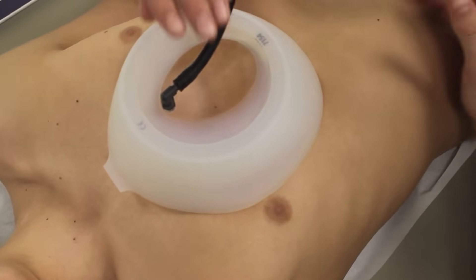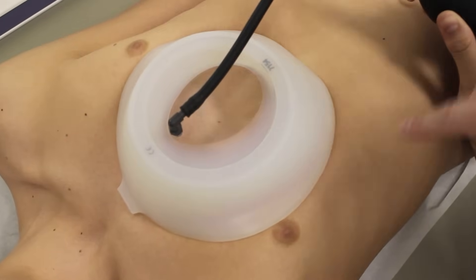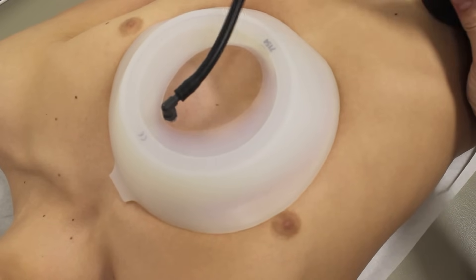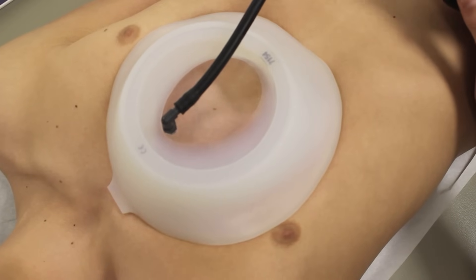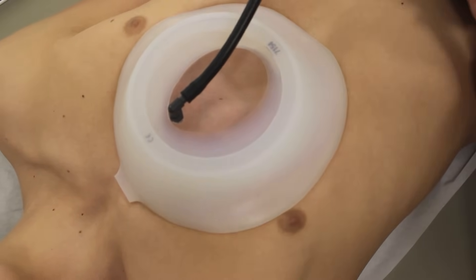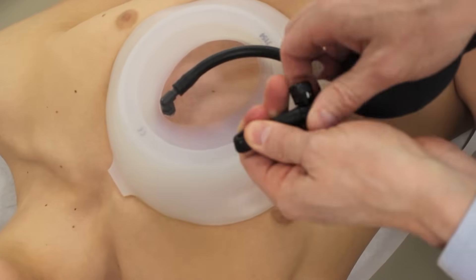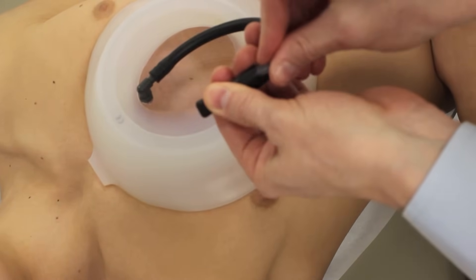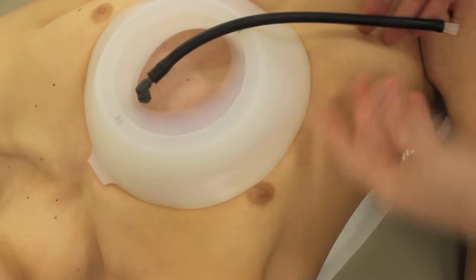Now we'll demonstrate how the vacuum bell lifts the chest wall. Move your hand, and you can see the chest wall down underneath the glass there. So that's lifted the chest nicely. Then what we can do is take the pump off like that — it comes with a silicone plug — stick the silicone plug in the end like that, and then release, and then the patient can sit up.